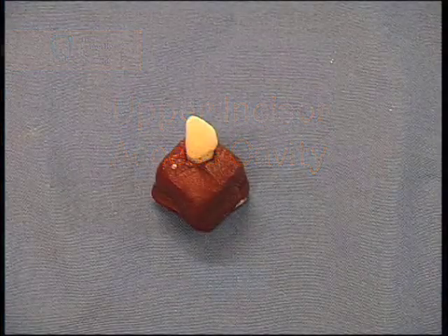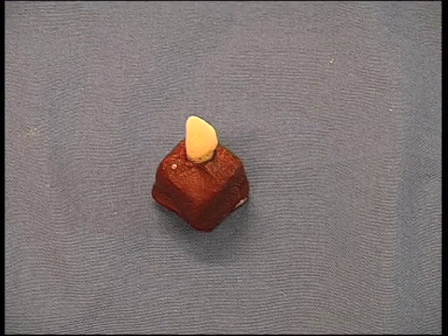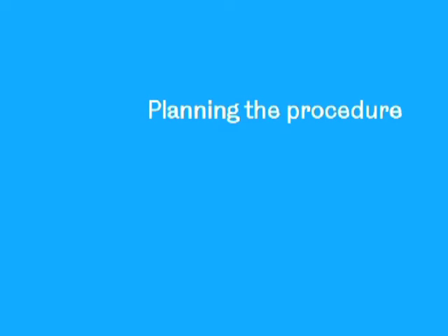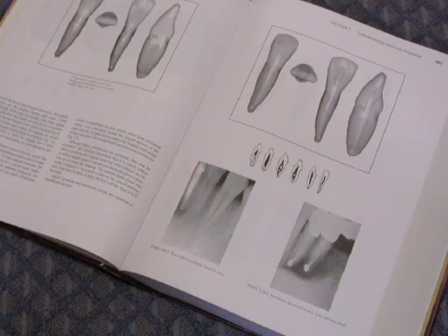The aim of access cavity preparation is to enable straight-line access to all of the root canal system. To plan the cavity, a good knowledge of the internal and external anatomy of the tooth is required.